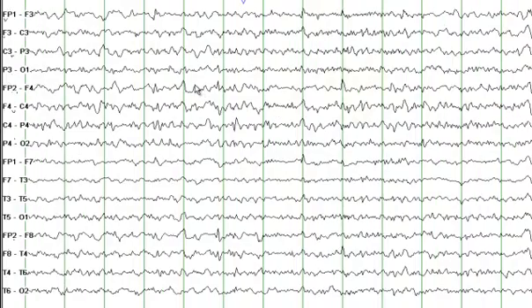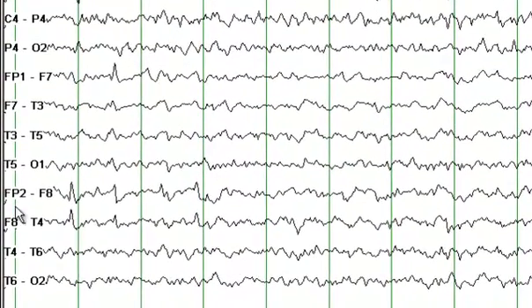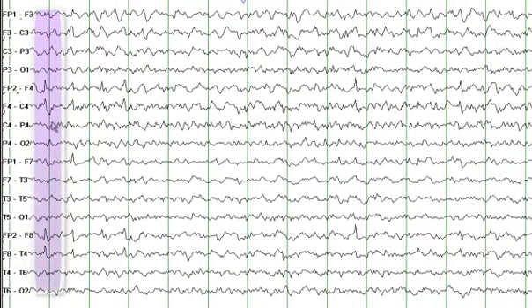The sharp waves are again seen in the right frontal central region, and you see the field extending into the right temporal region. When we compare FP2 to F8, an upward deflection basically has two meanings: either FP2 is more negative than F8, or F8 is relatively more positive than FP2. But when we look at the whole field, the conclusion is that it is actually FP2 which is most negative.